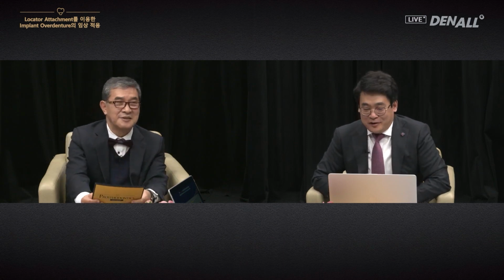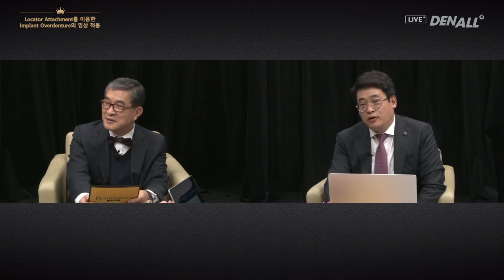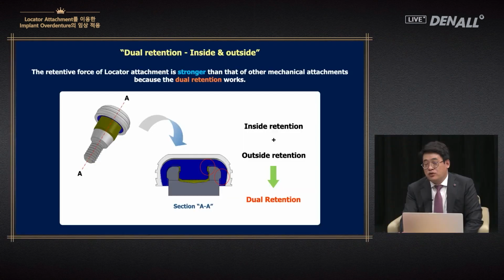What should be a removable prosthesis turns into a fixed one. One time the patient came in because the patient was unable to remove it for a week. The patient used the pink. Even if you try to remove it, yes, you and I have the same experience. Because the locator has a dual retention method, its retentive force is very strong.